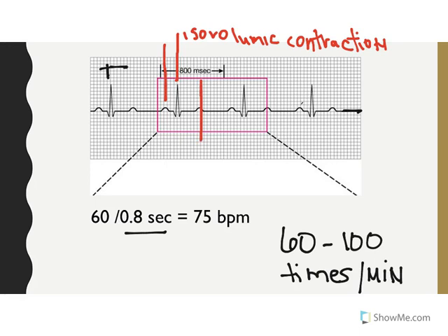During the T wave, about three-quarters of the way into it, is when the ventricles begin to relax. And the ventricles begin to relax during a period called isovolumic relaxation. So somewhere in this period right here, ejection had to occur. You get the pressures up, open up the semilunar valves, ejection. Ejection is followed by a period called isovolumic relaxation. So I just wanted to correspond some of the events in the electrocardiogram to events going on in the cardiac cycle. So this is just a basic overview of the electrocardiogram.